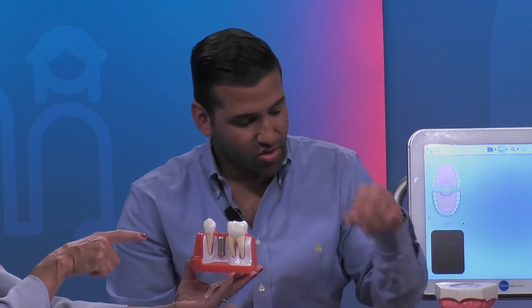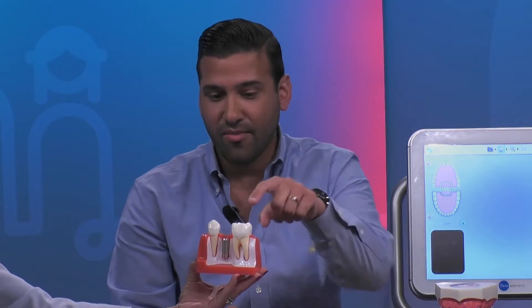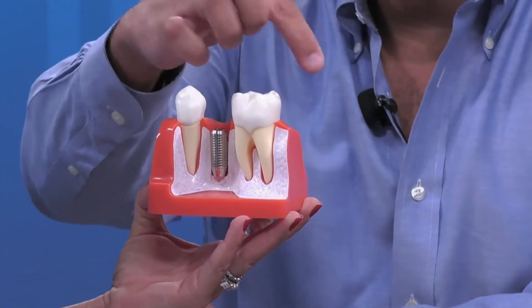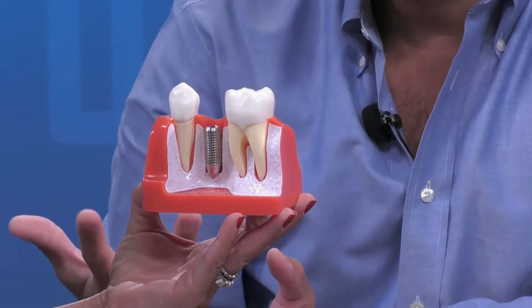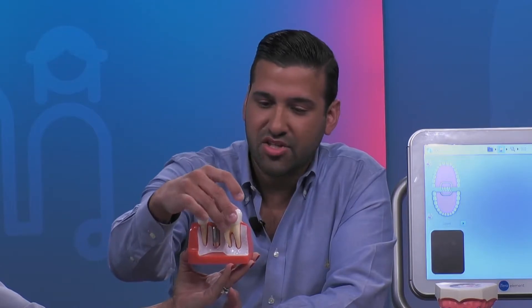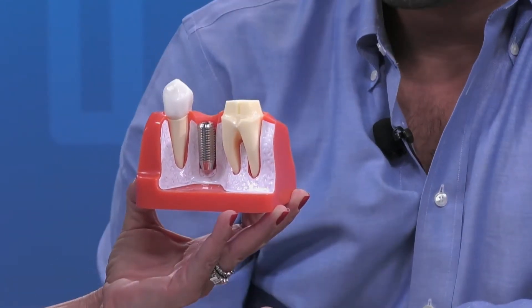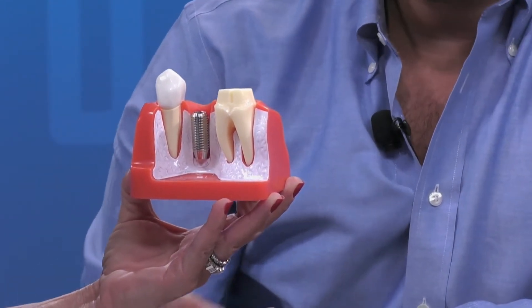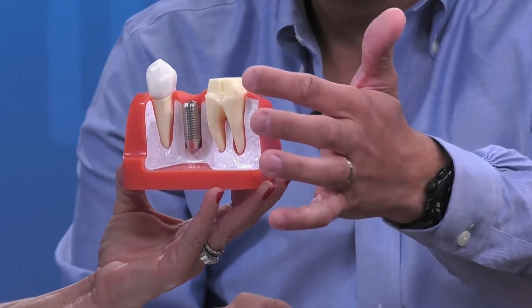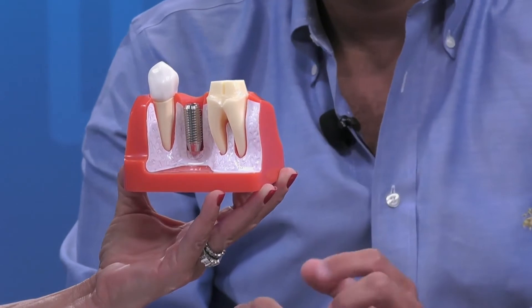So this is an implant. For the crown, I'm going to show you on this other tooth. Basically what happens is we clean up the tooth and we have to shave around the tooth in order to use the crown. I tell patients it's kind of like a shoe that's fitting on a foot. So when we shave the tooth down, it kind of looks like this — this piece shows the actual tooth structure, which you can see here. This is the top part of the tooth, and here you'll see the roots.